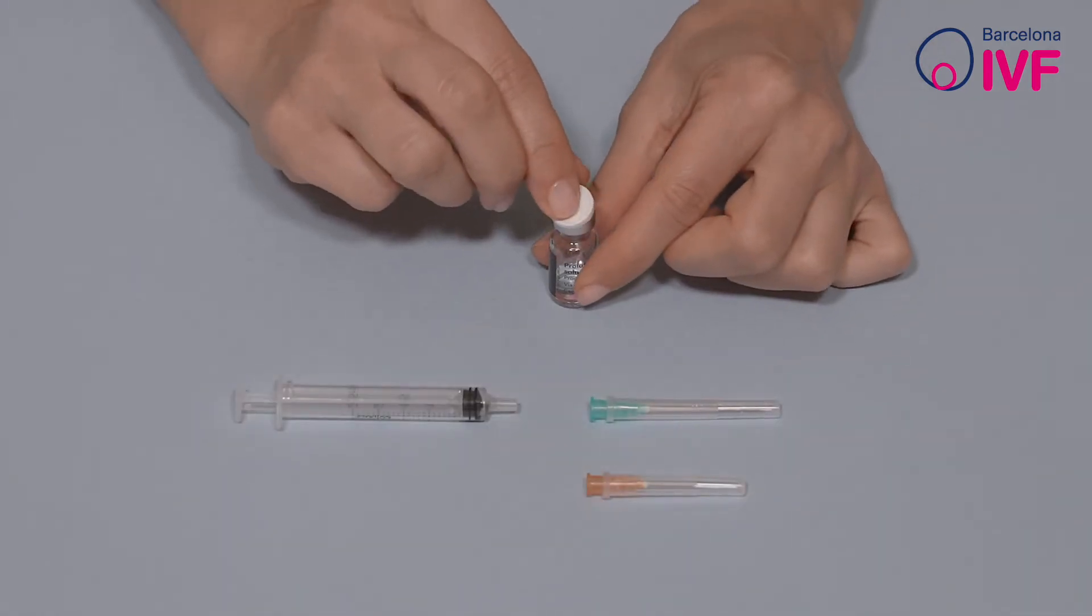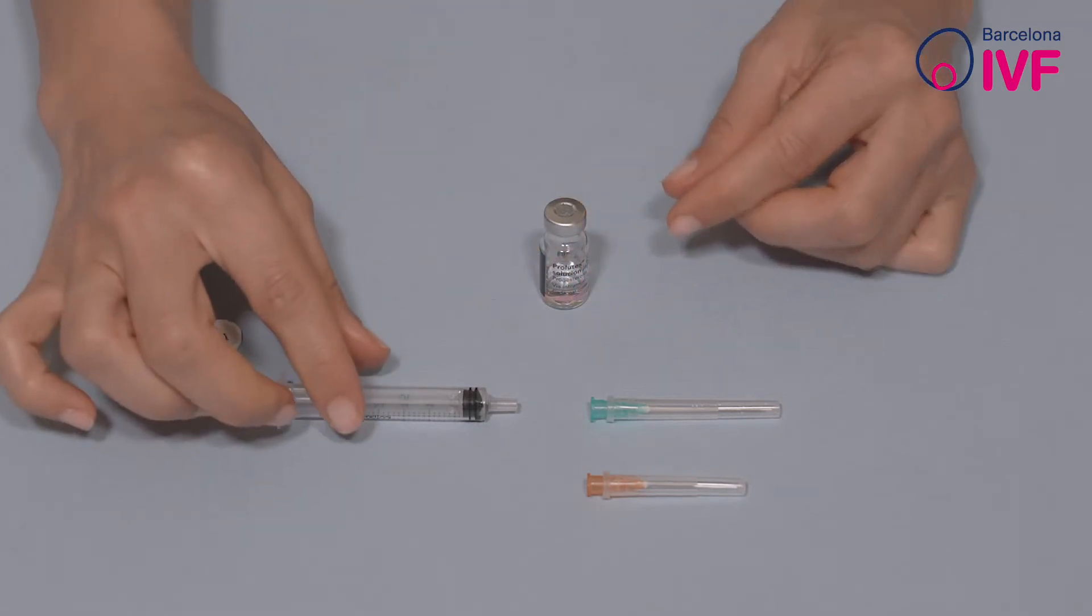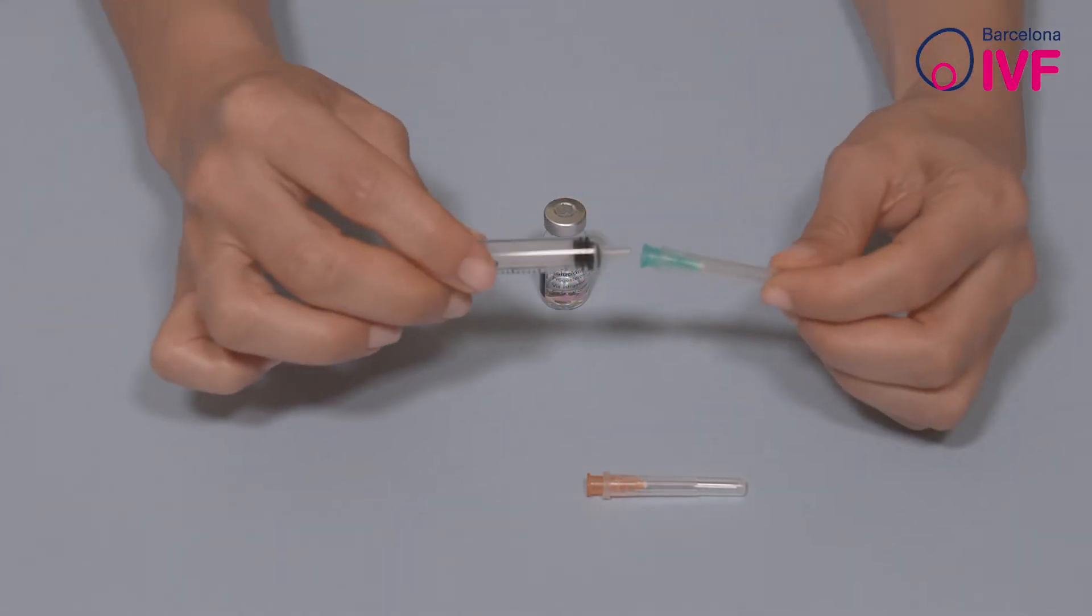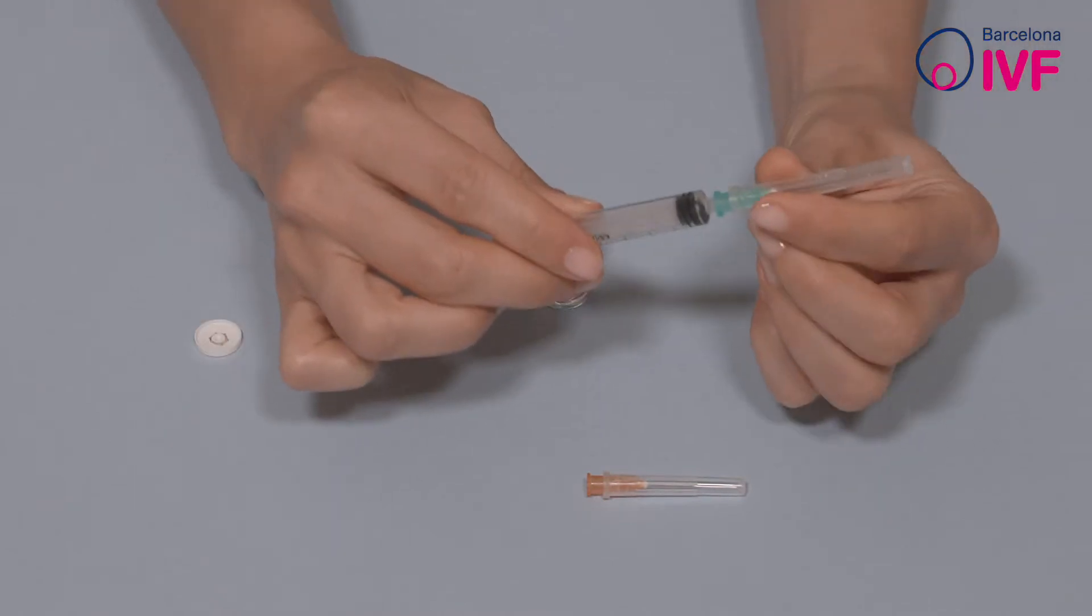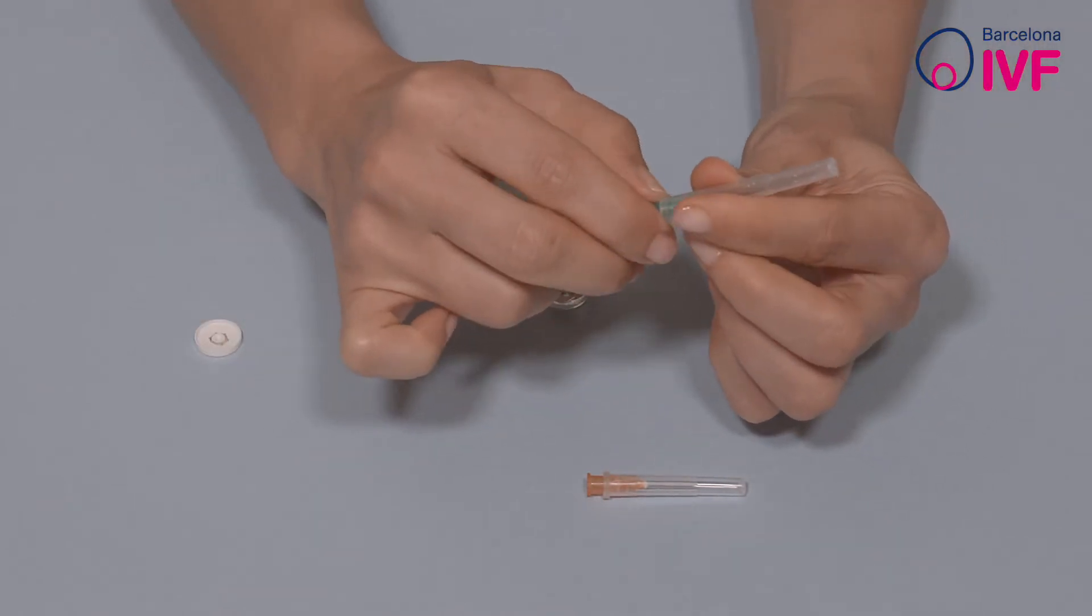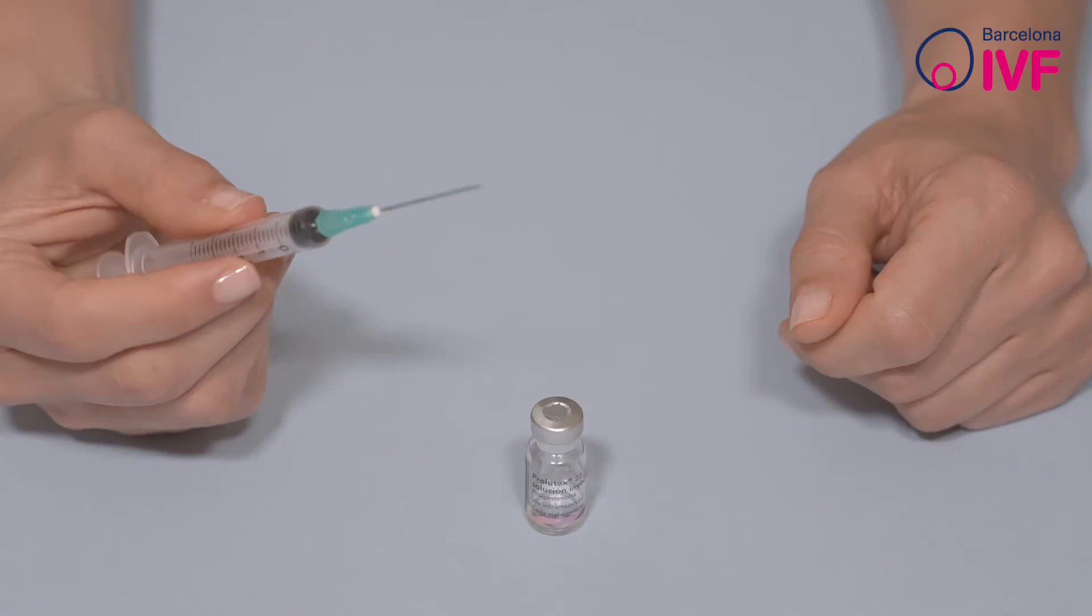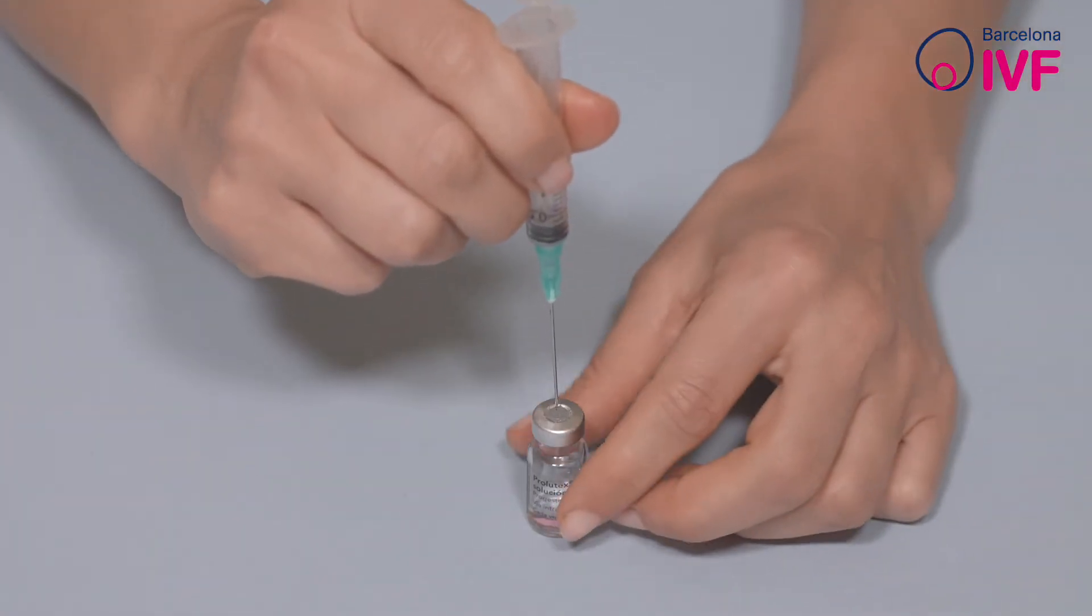Remove the cap from the vial. Attach the intramuscular needle to the syringe. Remove the guard from the needle and insert it into the vial of medication. Be sure the vial is resting on the table and your movements are as vertical as possible.